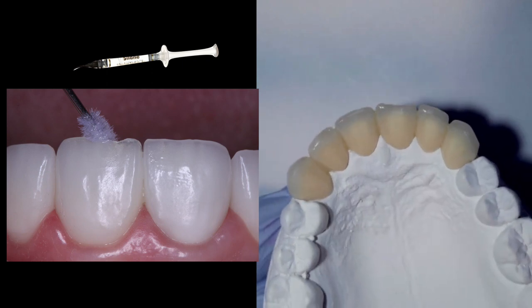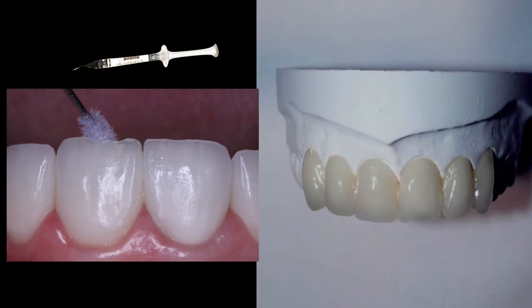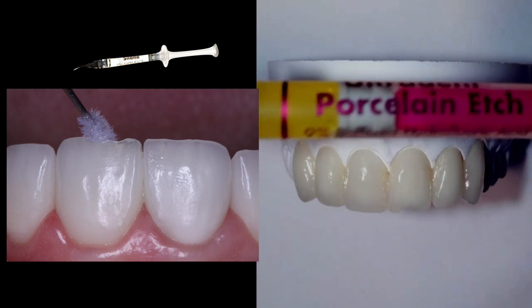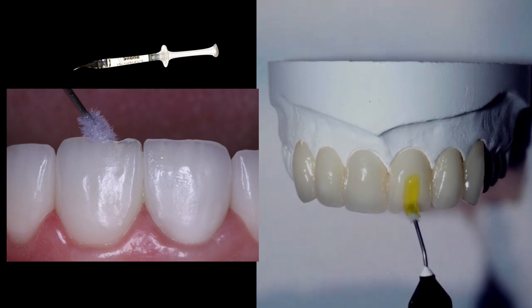Once we've placed the silane, I'm going to let that evaporate. It's going to slowly evaporate and you'll see it in the light — it'll kind of run a little bit. I wait; I really don't take an air-water syringe to it too quickly, and a lot of times I don't take an air-water syringe to it at all. I'm just going to let it dry. So we've utilized Porcelain Etch, and we're going to make sure that we have a really good silenated surface.